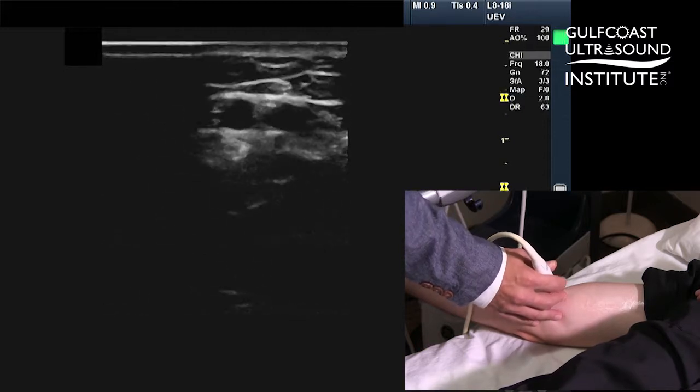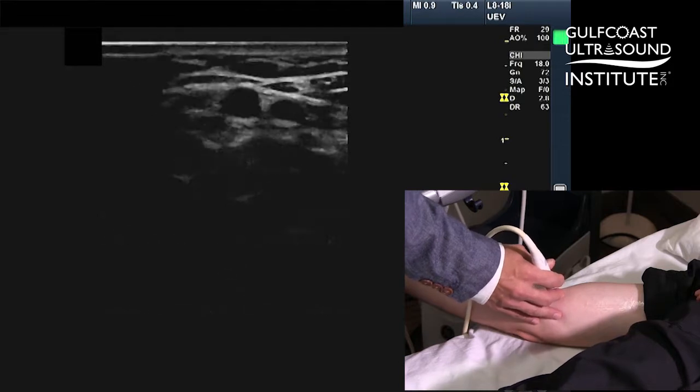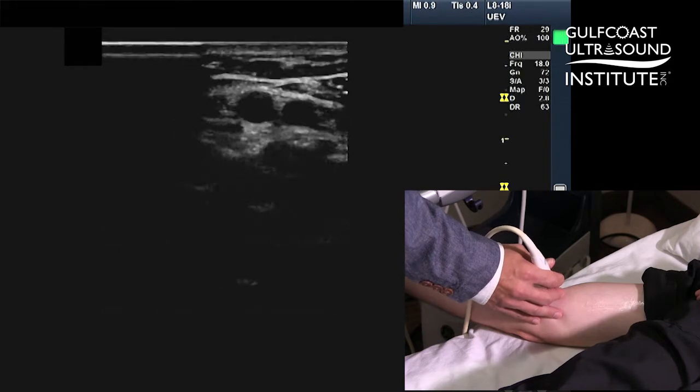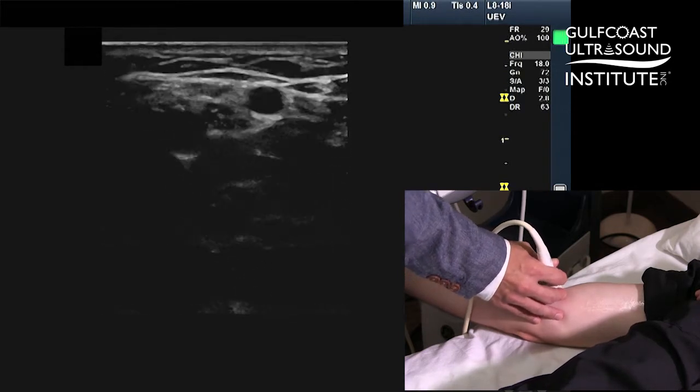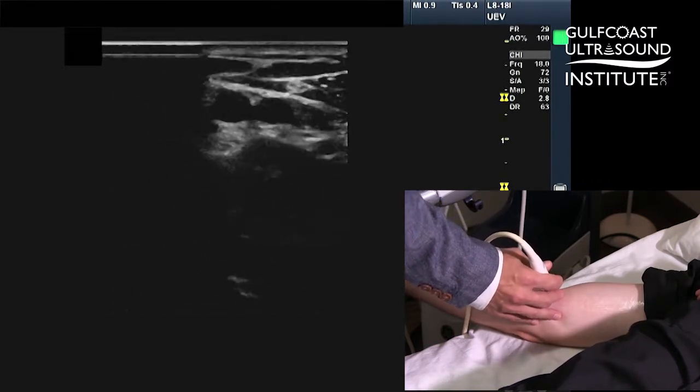It's important to do it slowly, because if you just compress really quickly, you can get an artery and a vein to collapse. Notice here that I'm putting a little too much pressure, so the vein is totally collapsed. I've centered myself on the artery, and then I'm double-checking — it collapses, and of course it collapses. So you don't want to do it like that, because you'll mistake an artery for a vein.